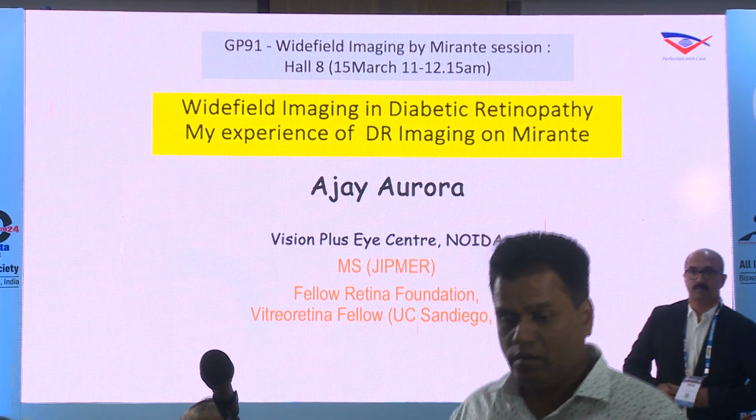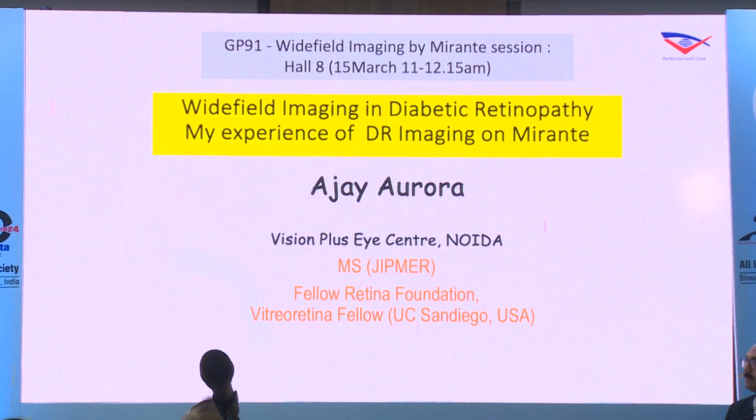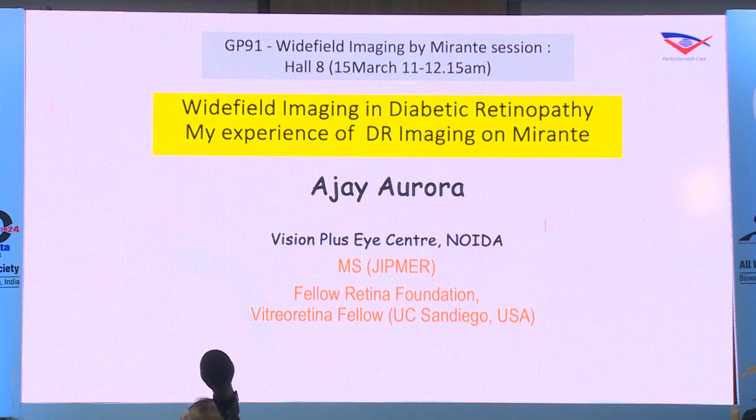Okay, so just to add on to what was just said about the problems related to the limitations, I find only one limitation with Mirante, and that is when you are taking a disc photograph, especially for the glaucoma colleagues. Because it is pseudo colors, you may not get the exact color. So when you compare disc to disc photographs, that's an issue.